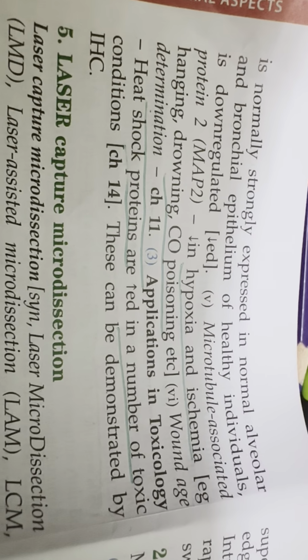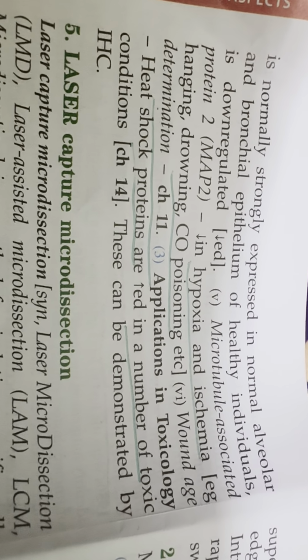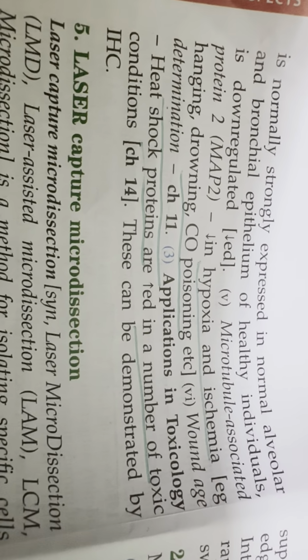Wound age determination. Application in toxicology: heat shock proteins are increased in a number of toxic conditions.